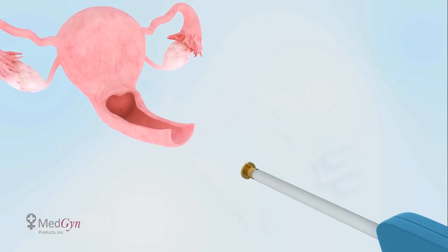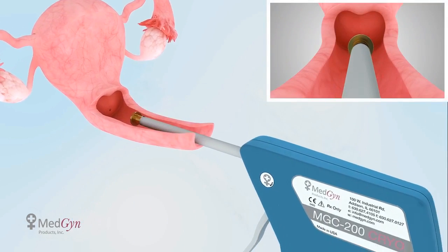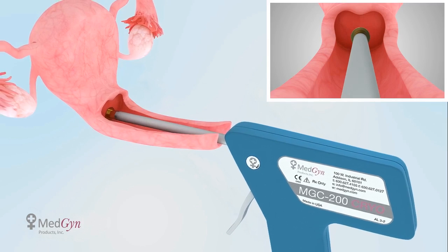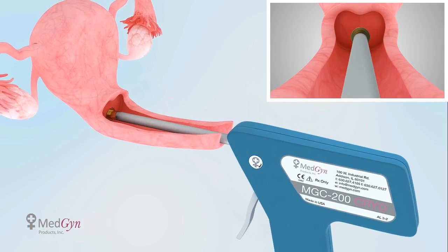Place the probe stem on the designated area. Squeeze the trigger gently until it latches into the first click position. This is the freeze mode. There is no need to maintain pressure on the trigger. Keep this position until the tissue is frozen.